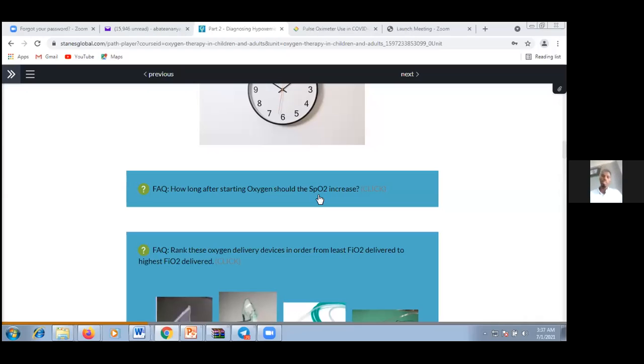Thank you very much. I have seen the trial and everyone has tried. Actually, it depends on the patient condition. Yes, it's right. As OR and critical care practitioners, we have to know the resaturation response time and desaturation response time. Once we put a patient on oxygen, there is latency, both to show the decline in oxygen and to show the increase in oxygen saturation.